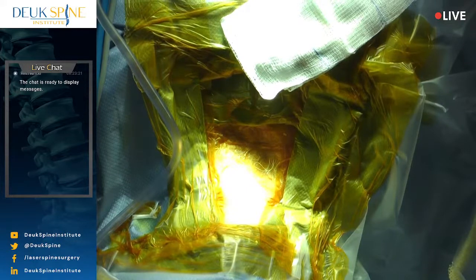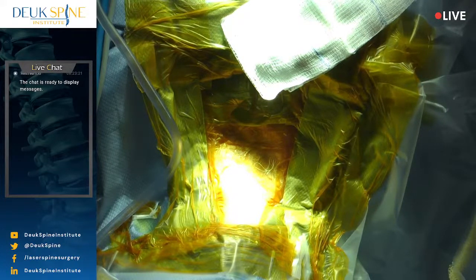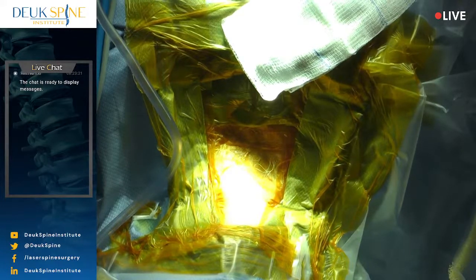So it looks like his jaw is above C3. So what I'm going to do is go to C3 first, I guess. Let's see. Probably C3 first, because if I pull the needle out doing C6-7, we can more easily put it back in. So we are on the right side. All right, are you ready? No, you're fine where you are.